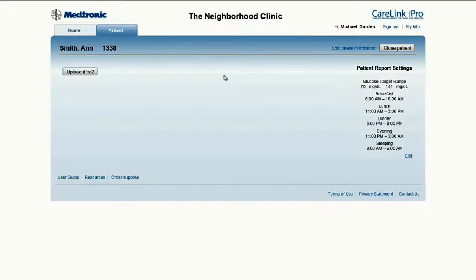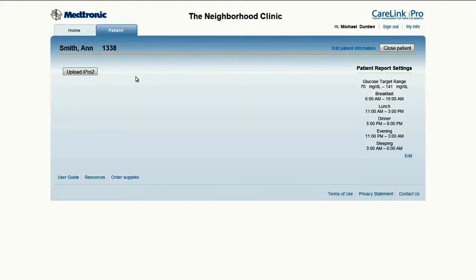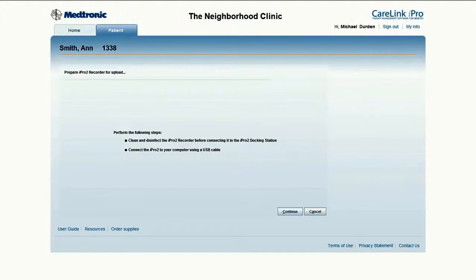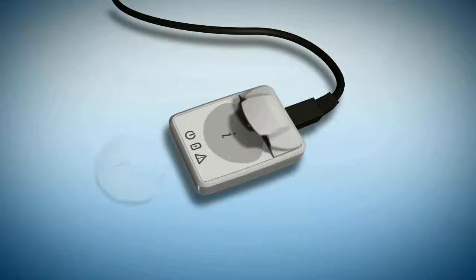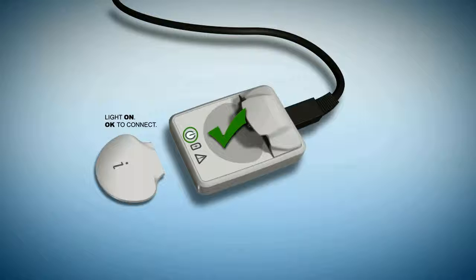Patient Ann Smith with patient ID 1338 has now been created. With the patient setup, it is now time to upload the iPro 2 and meter. Click on Upload iPro 2 to begin the upload process. The first step is to make sure that the iPro 2 has been cleaned, that the USB cable has been connected to the computer, as well as the smart dock.